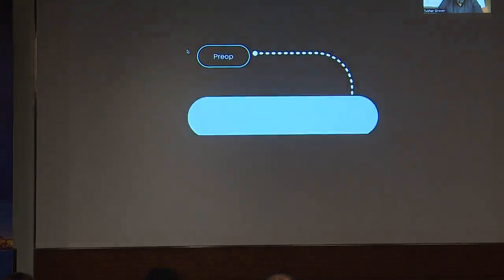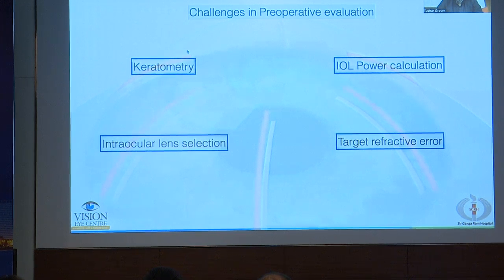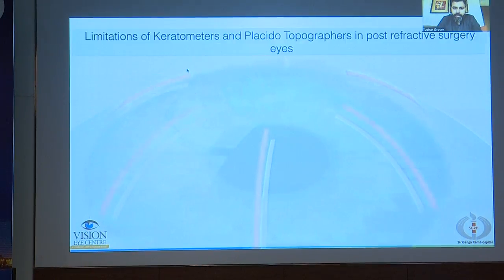So, starting with the challenges that we encounter preoperatively. Well, the biggest challenge in preoperative evaluation in these cases is that of keratometry and IOL power calculation. Then there's also the dilemma of which intraocular lens to implant, whether we should go for a monofocal lens or a multifocal lens, and what should be the target refractive error in these patients.